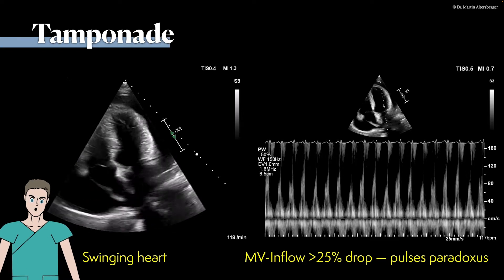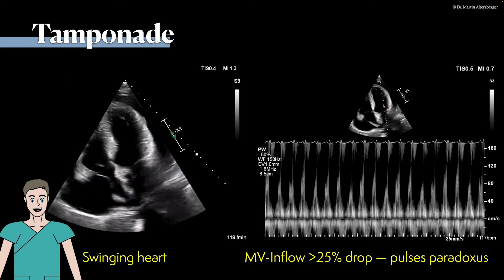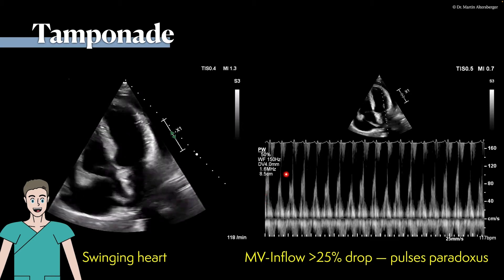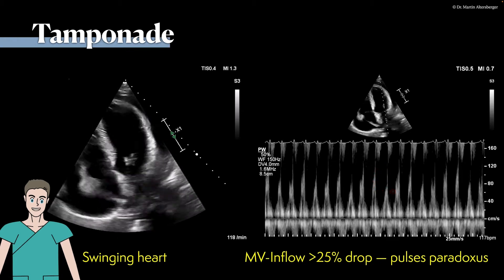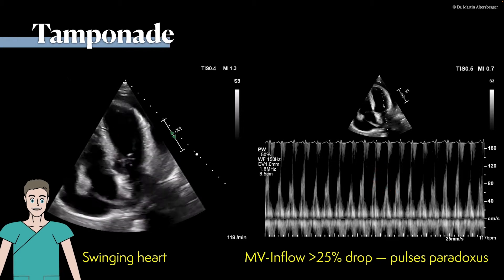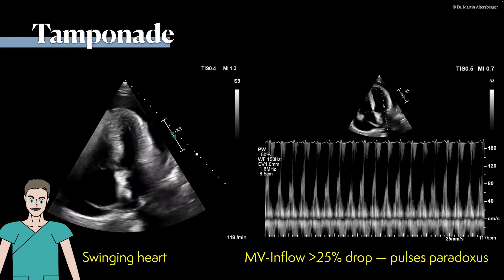We can also utilize a pulsed-wave Doppler measurement. We place the pulsed-wave Doppler at the tips of the mitral valve and take a look at the mitral valve inflow. We see a certain curve, and if there is above a 25% drop, it resembles a so-called pulsus paradoxus. This also confirms that the pericardial effusion is hemodynamically relevant — tamponade.